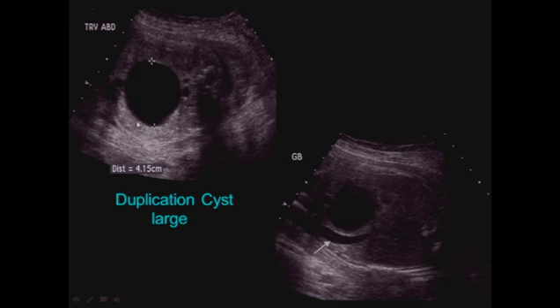Here's a much larger one, over 4 centimeters in the fetus, and you can see it here just pushing the gallbladder over. The gallbladder is draping over this cyst, which is unrelated to the liver.